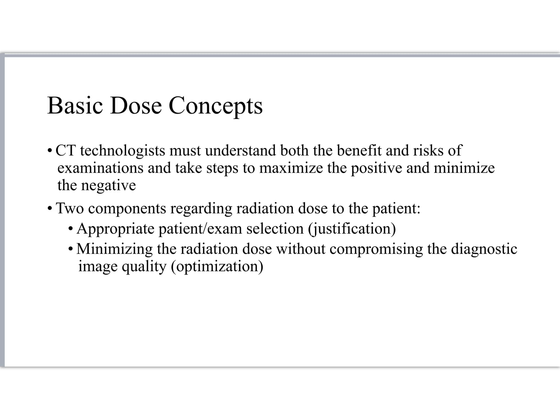How do we minimize radiation dose without compromising diagnostic image quality? And that's a big balancing act, because the reality is I can reduce patient dose and give you crappy images with a CT scanner all day long. So we need to find that middle ground.